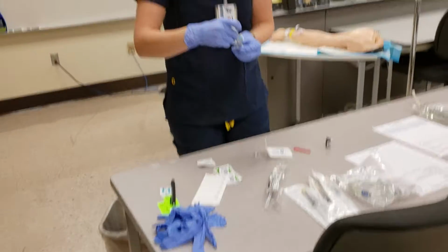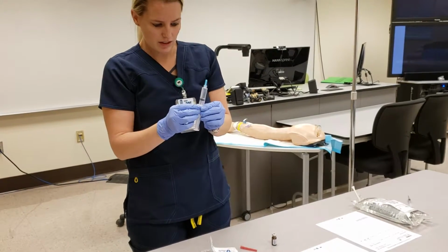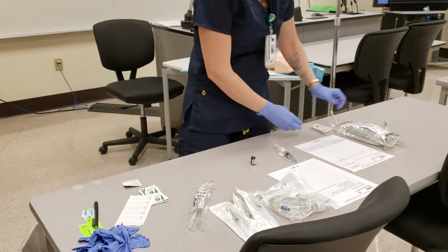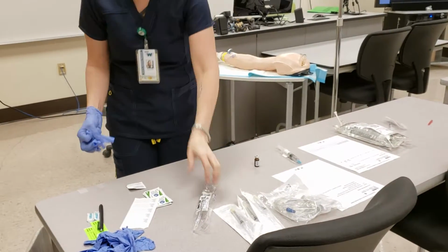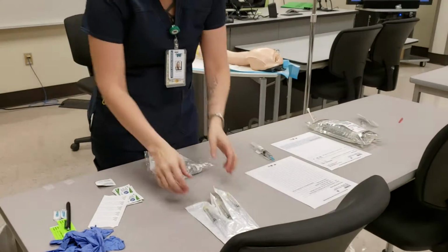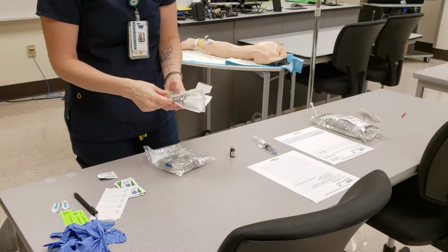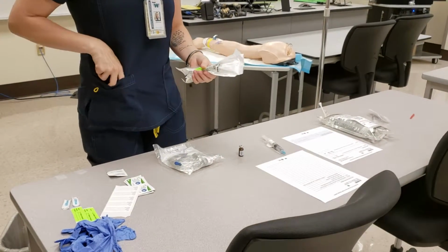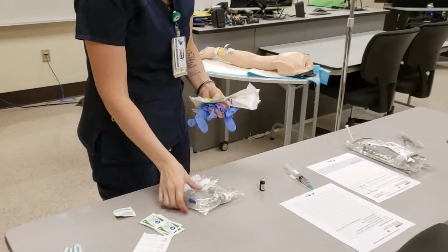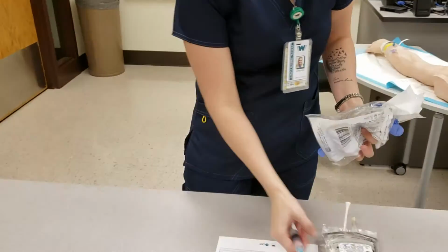So then I would label my syringe. And that is ready to go to my client's room. So I'll grab my IV tubing, my flushes, and the label for my tubing. My gloves. Discard this with another nurse.